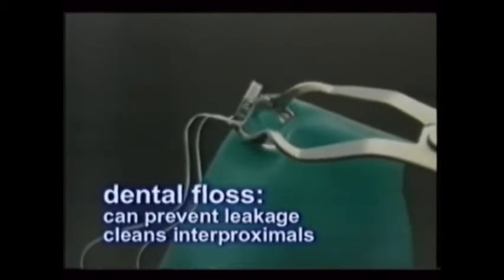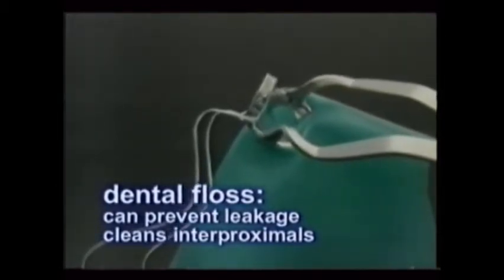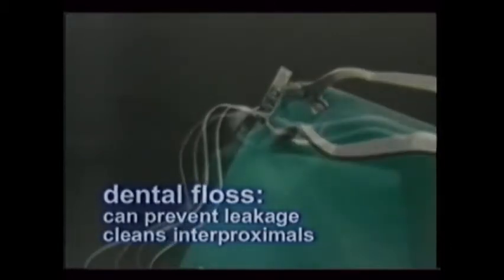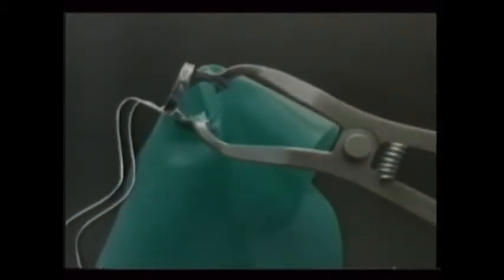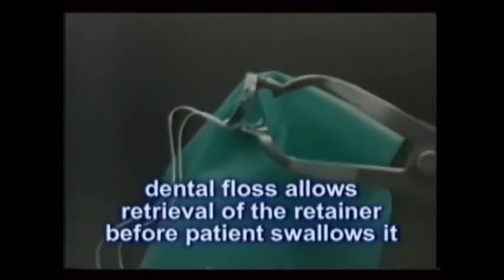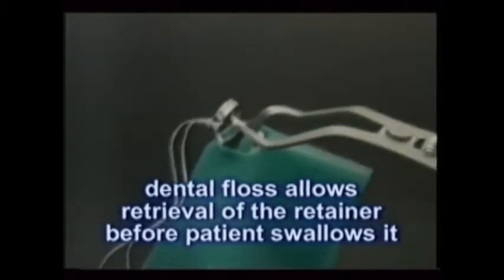Dental floss is used to secure the rubber dam and to prevent leakage, as well as to remove polish and help clean the interproximal areas after placement of the filling. Notice this floss's attachment to the rubber dam retainer. This is extremely important — if the retainer clamp were inadvertently to spring loose, the floss would help you retrieve it before it becomes lodged in the patient's throat.